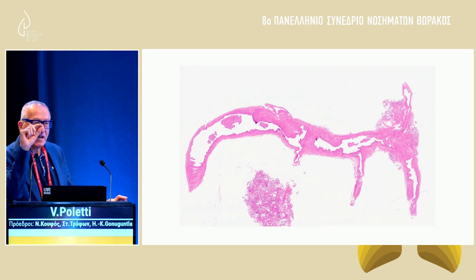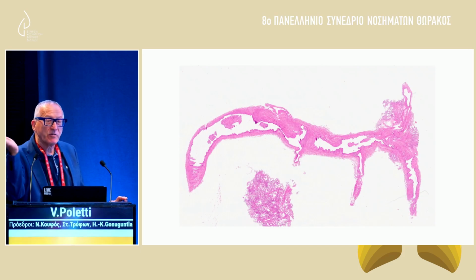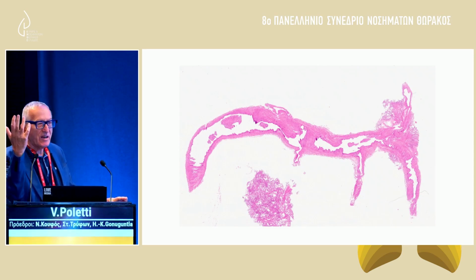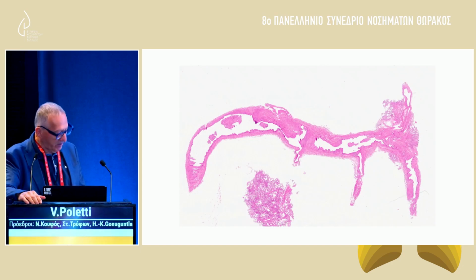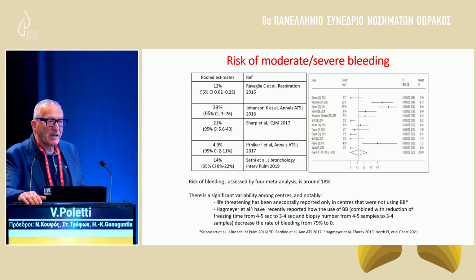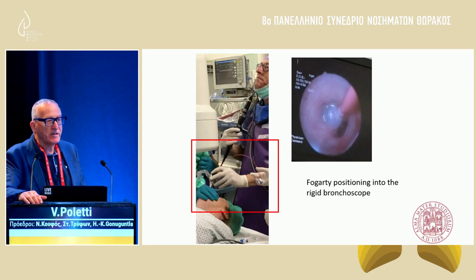So in CT scan, when you have a large vein, pay attention. Why? Because if you want, I don't suggest it, but if you want to commit suicide, you don't tear the radial artery. You tear the veins because the elastic component in the vessel is not so relevant, and you can have bleeding for a long time. Major bleeding is a life-threatening complication, so for that reason you need some control, and the Fogarty balloon is very important.